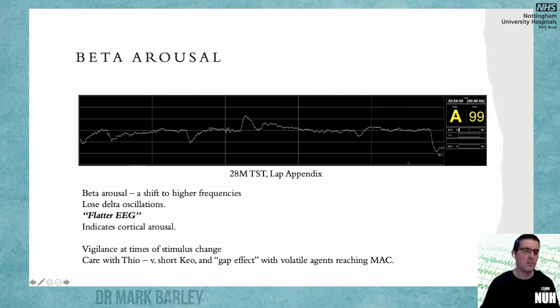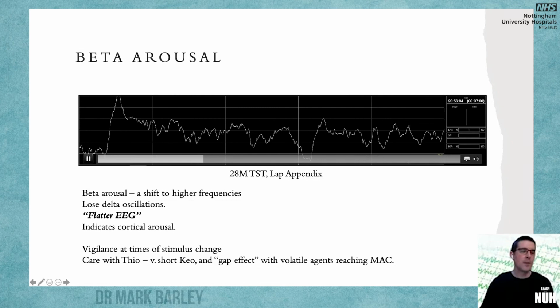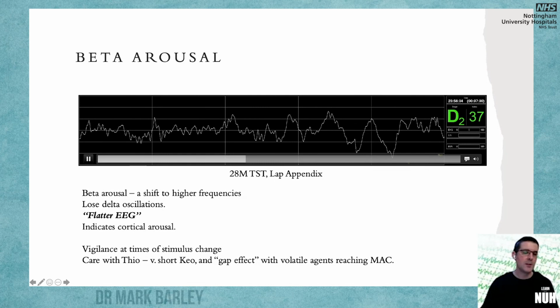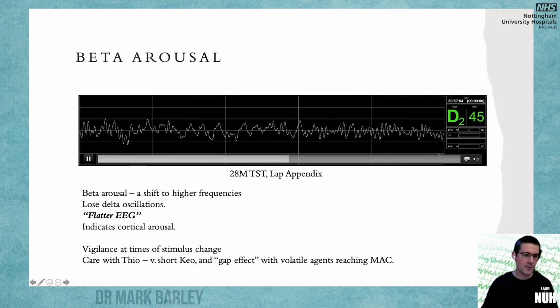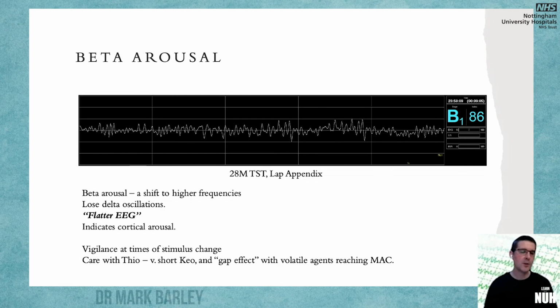So, inducing anesthesia now, starting to see these higher frequency oscillations. In a moment, we're going to see some enormous, there we go, slow waves, lots of slow waves and delta waves, hit the brainstem hard. The machine's indicating appropriate anesthesia. Intubation occurring now. Watch how we lose those slow waves and delta waves and the EEG becomes flatter. This is the sign of a brain that's starting to wake up. Narcotrend is recording that. See, we've still got those alpha oscillations, but we've lost those slow and delta waves following the stimulus of laryngoscopy and intubation.